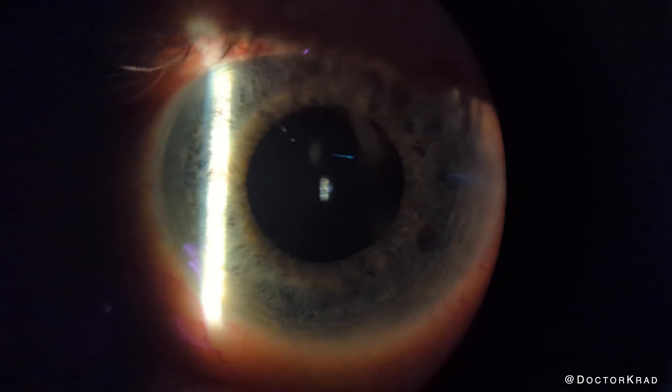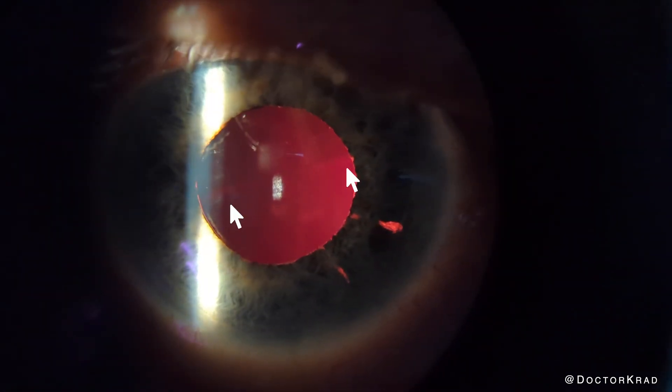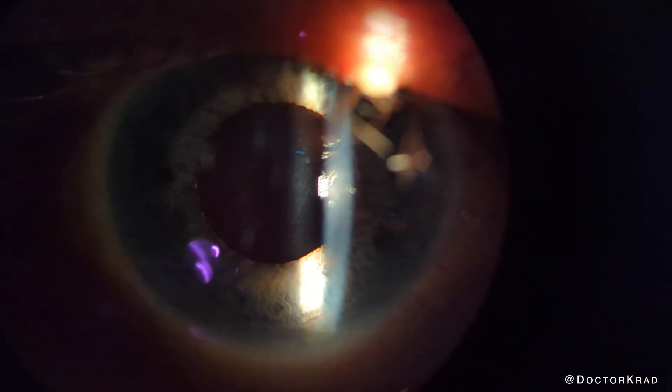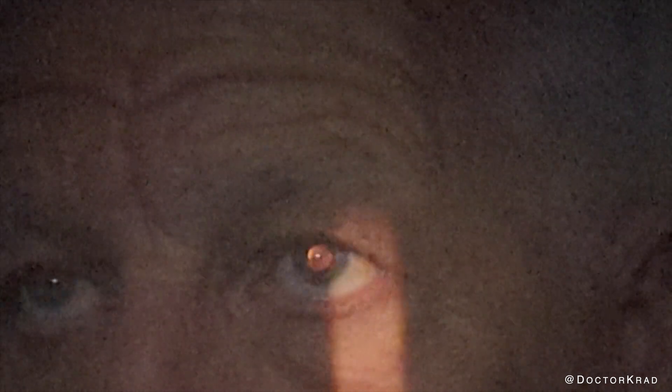Here we are at the slit lamp. You can see the transition zone between the far segment and near segment. This is with the eye dilated. When the eye is not dilated, this lens looks like a monofocal lens — I could barely tell the difference. It is more apparent on retinoscopy. Here I am putting my camera through the retinoscope, and you can see a much more prominent distinction between the distant and near segment.